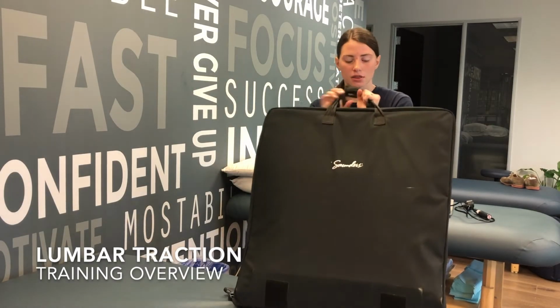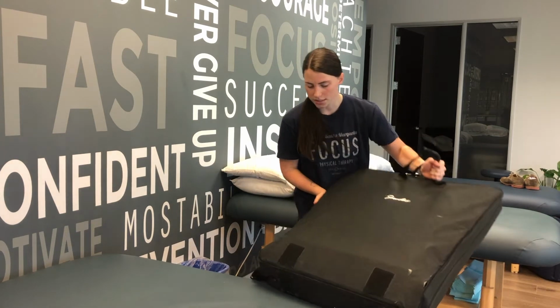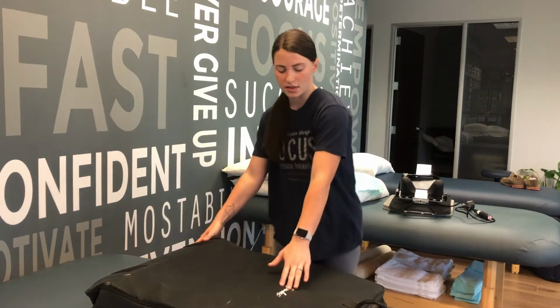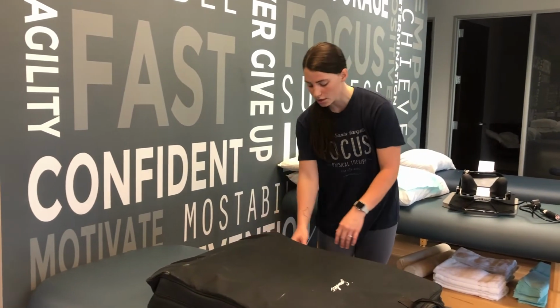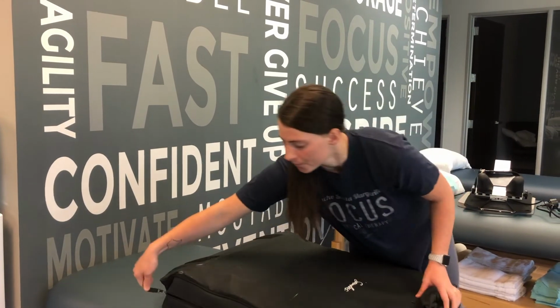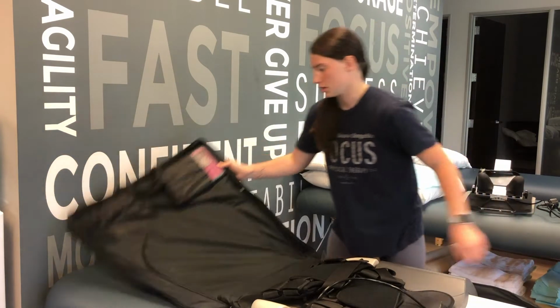We are going to be setting up lumbar traction today. So the traction unit comes in this little setup right here. You usually want to set it up on one of the tables with the Saunders logo pointed upward. There's zippers on the side where you unzip, and then it just folds open like so.